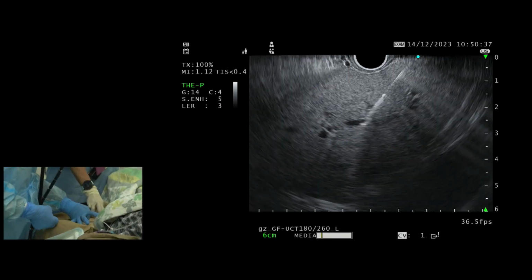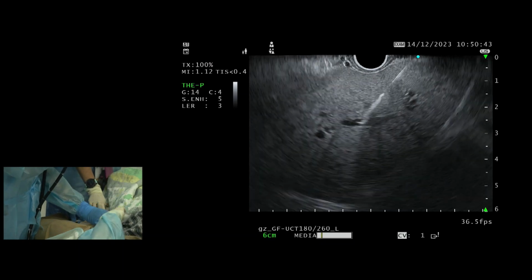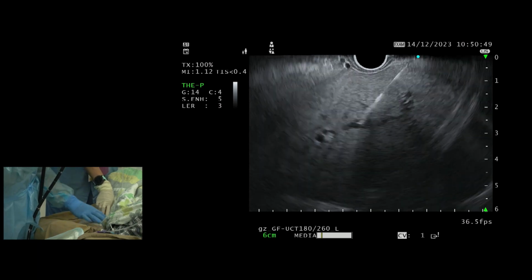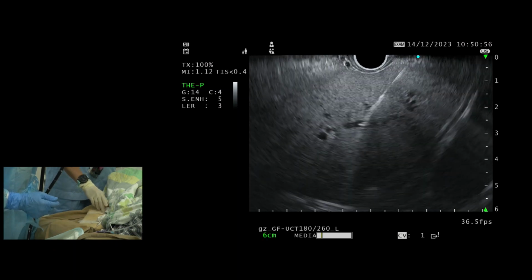Oh, it's 7, 8. So now it's dropping to around 9 and 10. Okay, 9. All right, so we take the lowest stable value. How long do you wait? About 30 seconds. Okay. So this is good. Let's flush it again. Okay. I'm flushing it again. Perfect. We saw some microbubbles. That's great.